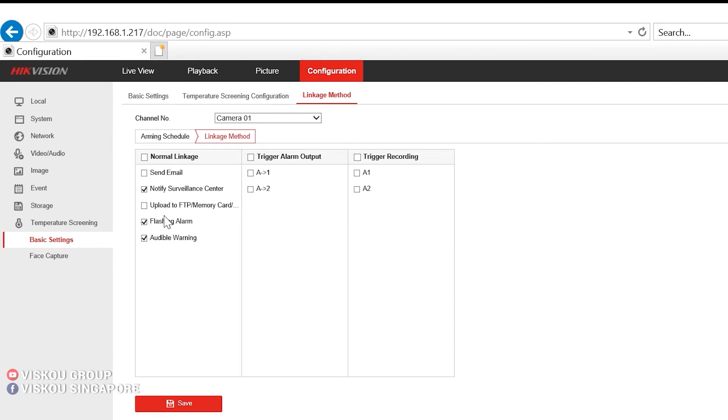For these two special alarm alerts, you can set the volume and also the brightness. So for the brightness of the light, you can go under event.